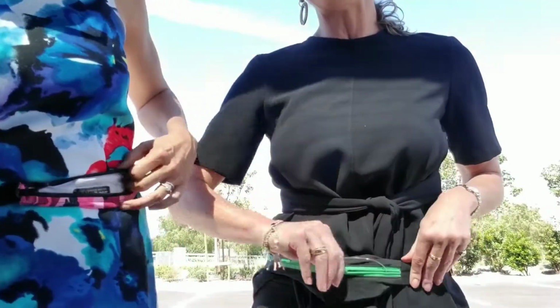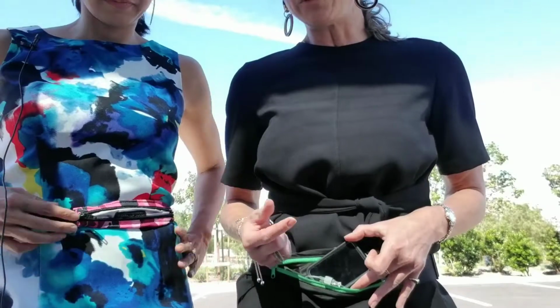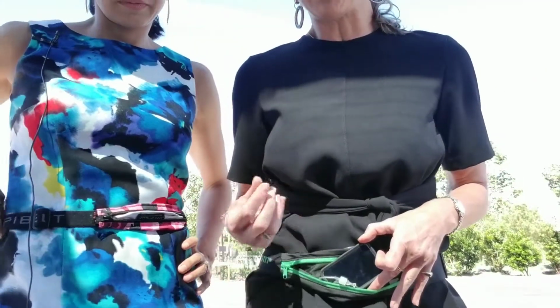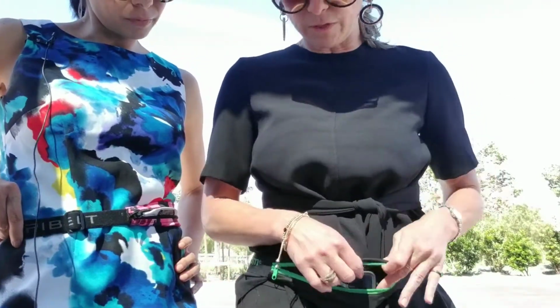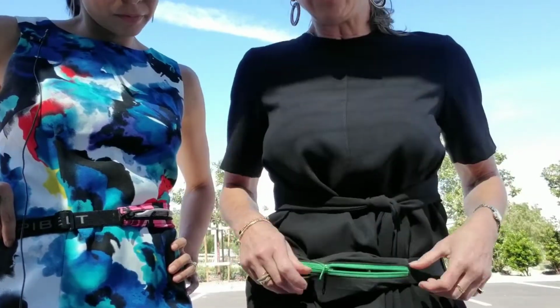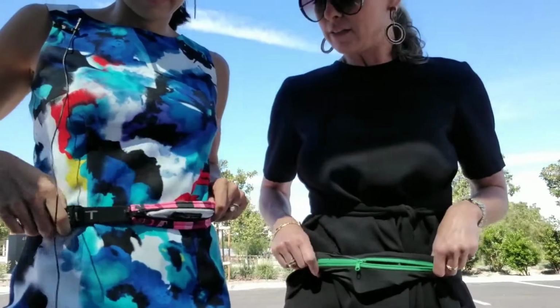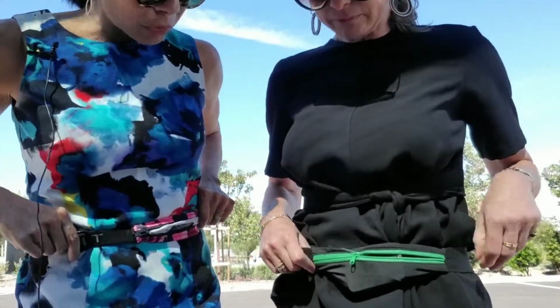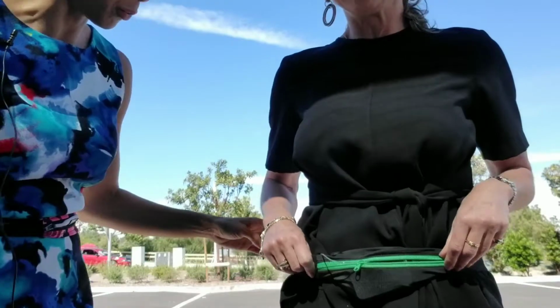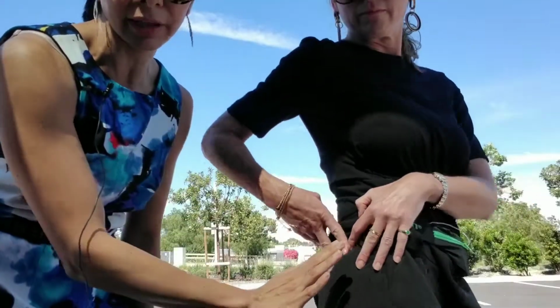So then I have easy access to change out my insulin doses if I need to, and grab any goos or so forth that I might need as well. So that's how I would use a pouch to wear my pump around my waist. And I did want to mention one thing too. Her infusion set is very low profile, so you can't even see it. It doesn't bulge out or anything.